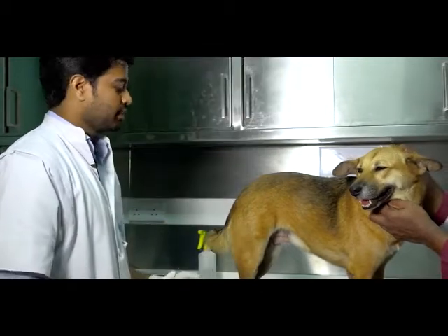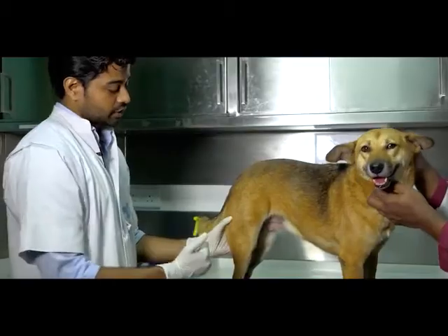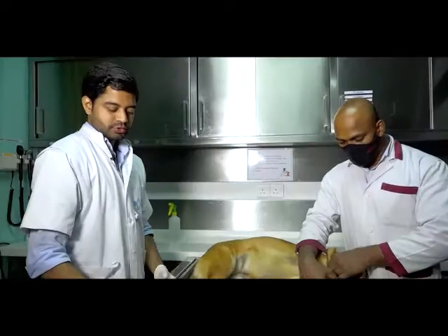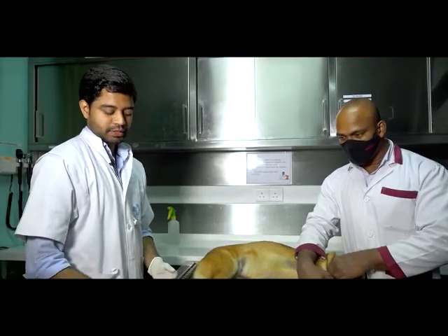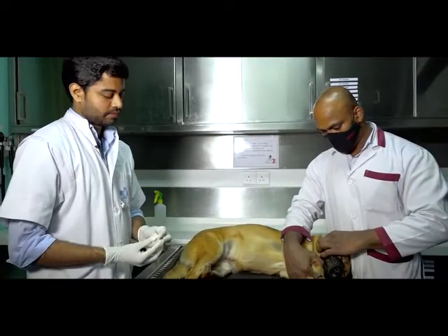Well, for Hamina, I would prefer going for the hamstrings, but you always have to be aware of the sciatic nerve that runs along, and you should always be vigilant to avoid that. So we're going to administer the drug. For that we have the injection which is loaded with the drug, and also once again we have a cotton swab that is soaked with 70% alcohol.